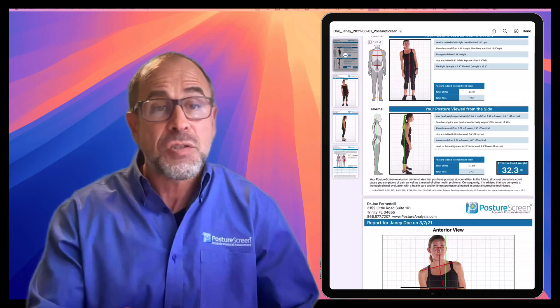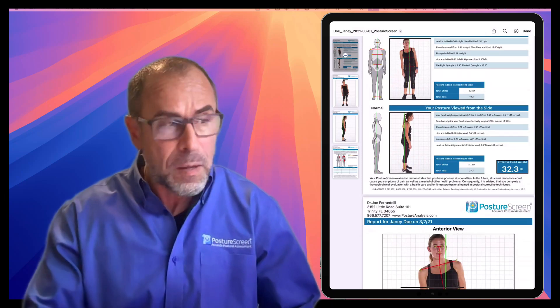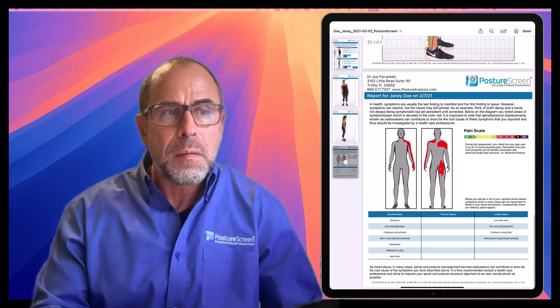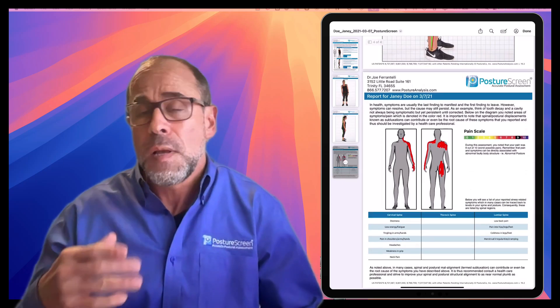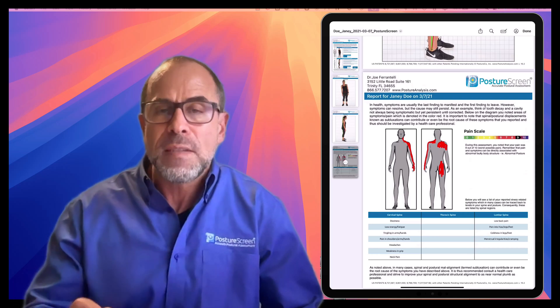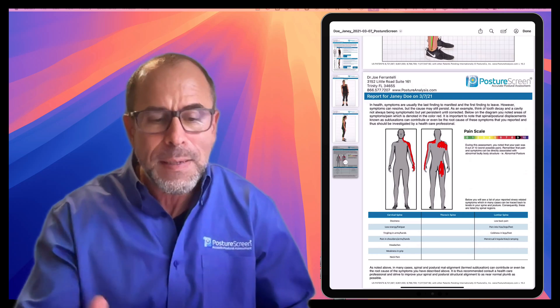Generate the report. So a patient would get something simple like this type of documentation report that explains their forward head posture, their head weighs 32 pounds, and you can even document their pain on a pain diagram as well as visual analog scale. So it's quite comprehensive, but again, it gives the documentation in terms that they need to understand.